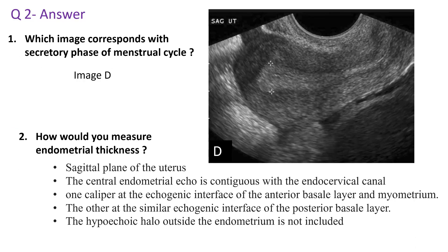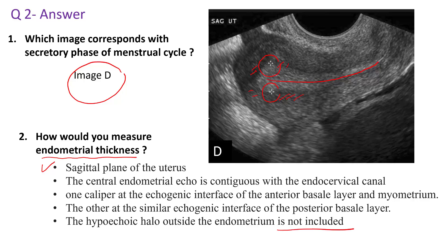The answer to the second question: image D corresponds to the secretory phase of the menstrual cycle. Regarding measurement of endometrial thickness, obtain a sagittal plane of the uterus. The central endometrial echo is continuous with the endocervical canal. Place one caliper at the echogenic interface of the anterior basal layer and myometrium, and the other caliper at the similar echogenic interface of the posterior basal layer. The hypoechoic halo surrounding the endometrium is not included in the measurement.